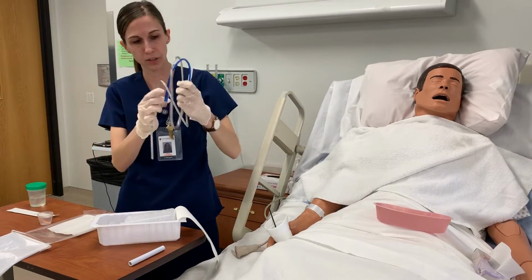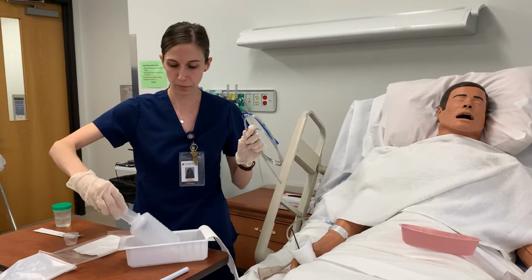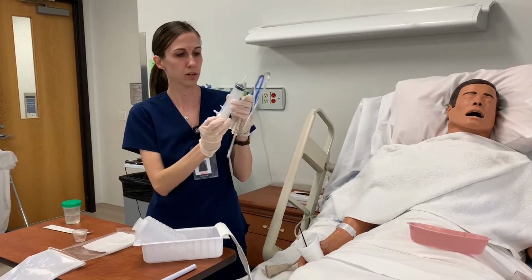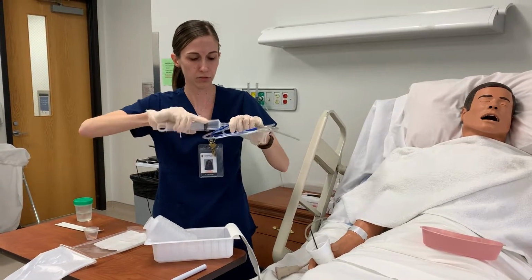And then other than that, I'm going to grab my NG tube. I'm going to attach the piston syringe. I'm going to bring up a little bit of air, about 30. Have that readily applied.